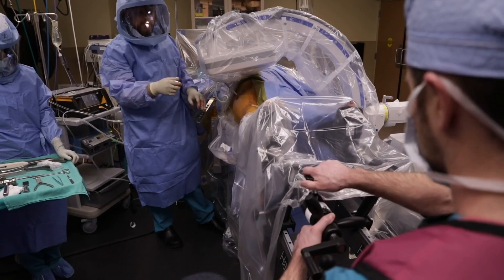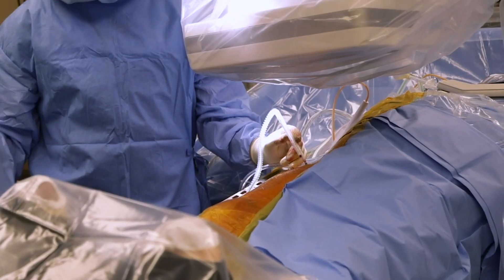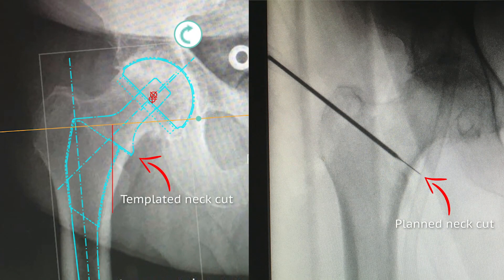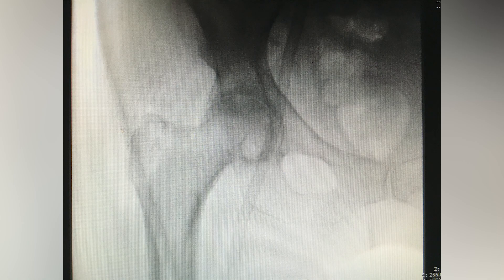The C-arm is positioned 10 degrees over with the leg internally rotated 10 degrees. This is done to maximize the patient's femoral offset. I then mark my planned neck cut with a bovie tip and compare this to my templated neck cut. The image is then fine-tuned to obtain a perfect image of the proximal femur with the head centered on the image to prevent parallax.